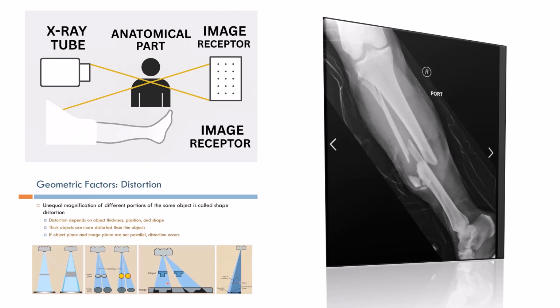An experienced radiographer must be able to adapt standard positioning protocols to ensure the areas of diagnostic interest are optimally demonstrated. Achieving this requires a thorough understanding of radiographic geometry, specifically the spatial relationships among the X-ray tube, the anatomical part, and the image receptor. By mastering these perspectives and alignments, the radiographer can modify technique to accommodate position, condition, pathology, or clinical context while still producing images that meet diagnostic requirements.